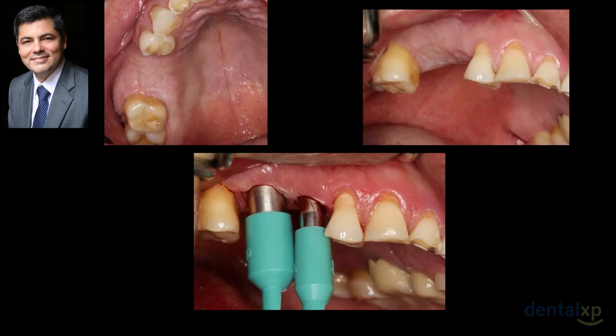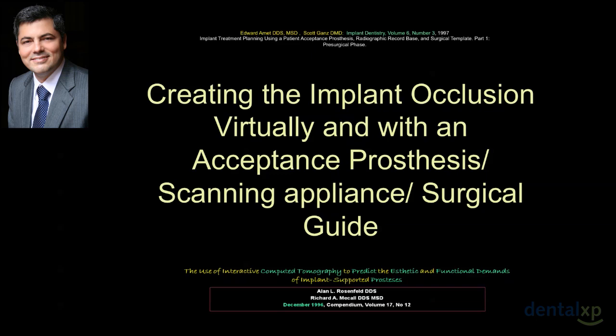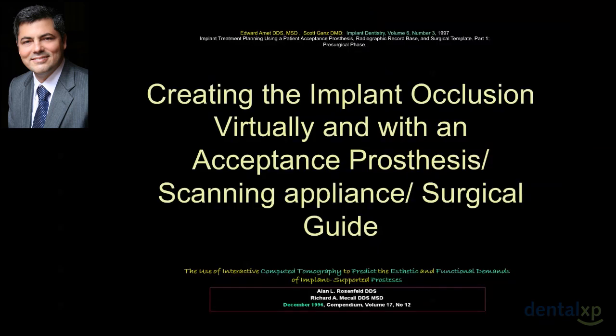So now that we have been able to create the right treatment plan, or the best treatment plan that we are able to select for this patient, at least from the implant standpoint, we proceed to actually prepare the site. This is a guided surgery process, and wide implants, long implants are placed to be able to reconstruct this patient and bring him back into having his teeth. After this situation is done, a new splint is created for this patient.